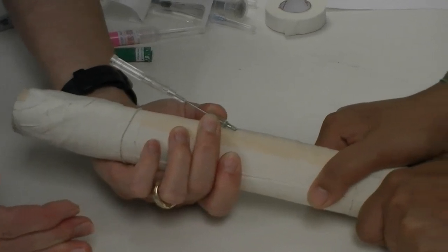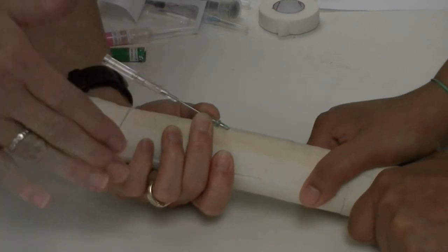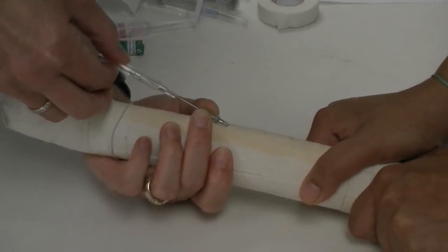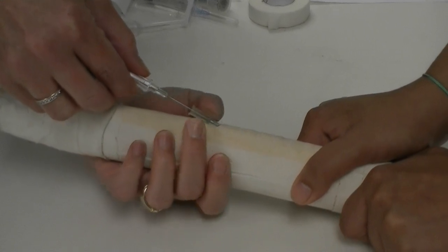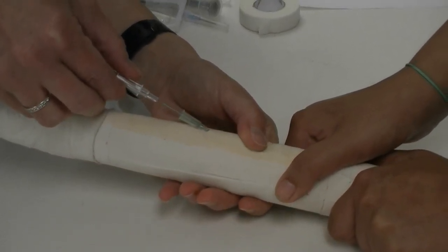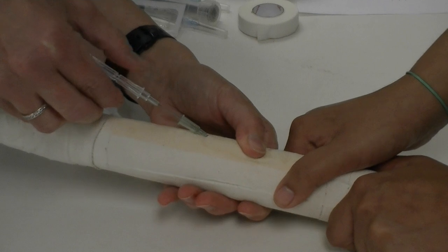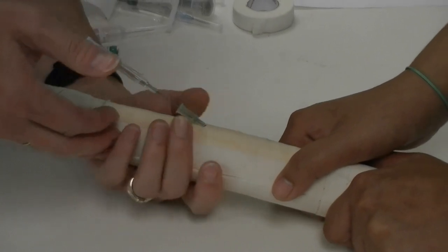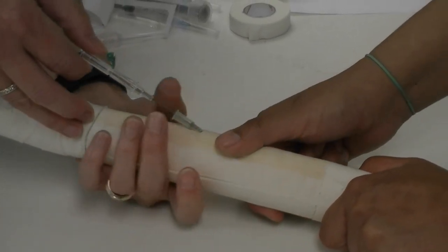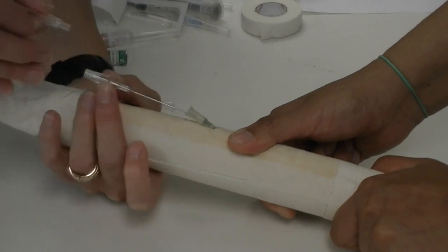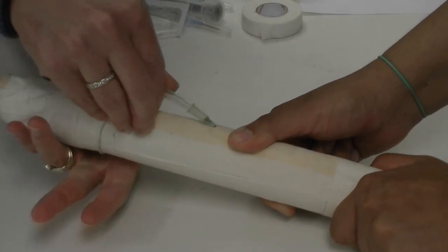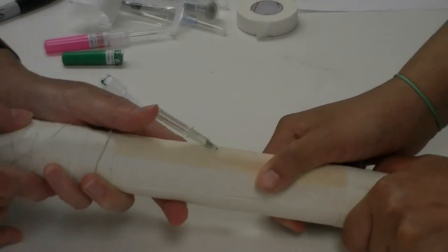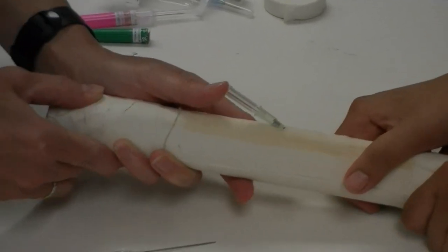Now when I remove my stylet this will be patent, so blood will come out. It's okay—blood is a good thing, that means we have a patent catheter placement. Don't worry if a little bleeding is happening. Remove the stylet. If your patient is calm, you can have your assistant occlude the end of the catheter portion and keep this from bleeding as you're attaching your attachment pieces. I'll pull the stylet all the way out, remove that temporary cap, and place my thumb on the end of this cap. This way if my patient moves, my catheter still has stability and doesn't just come out.